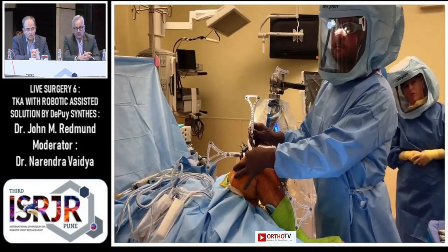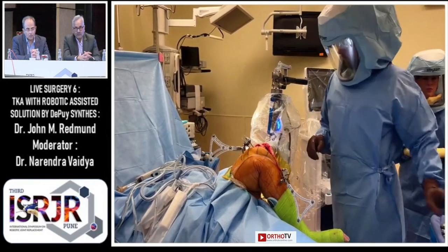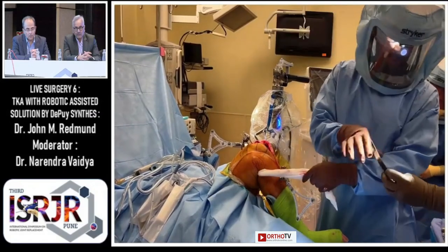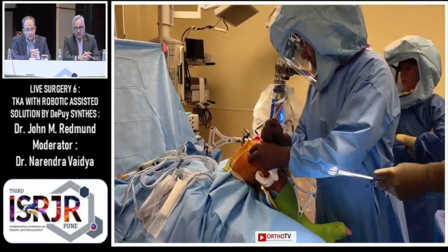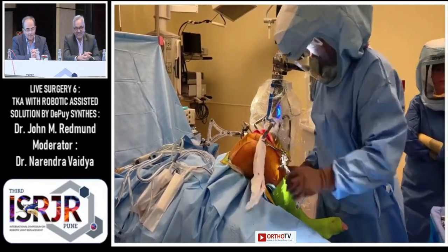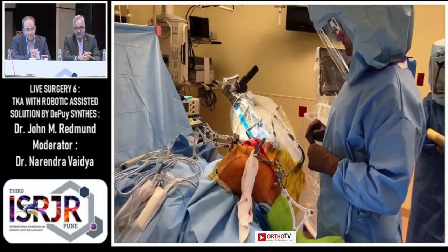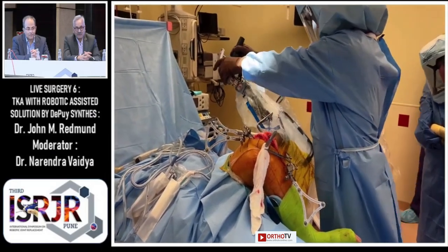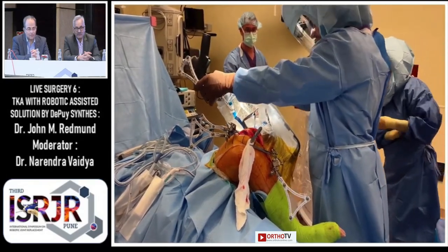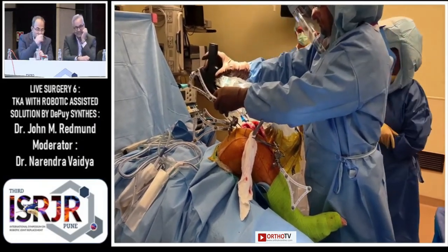Once the plan is set, the rest of the case is straightforward — all I have to do is cut and implant. I use a self-retaining retractor system and prefer no assistance around when cutting, as they can interfere with the arrays. I place a 90-degree Hohmann over the extensor mechanism on the lateral side of the tibia and a Z-retractor medially under the medial collateral ligament, then cut without any assistance.